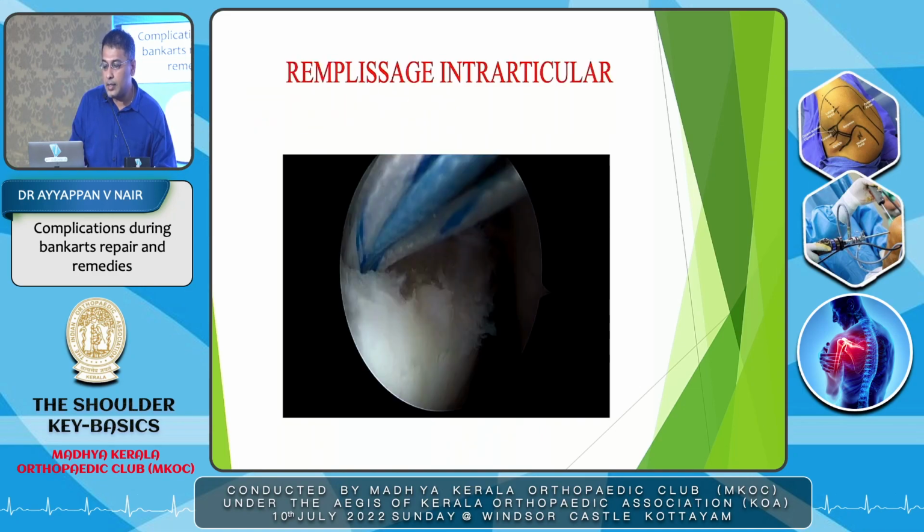So then that is about what are the normal complications. And the other thing is a complication which we feel. So how much of a bite? The bite I showed you, how much of a bite. Lasso, how to take it. And there are instances, if you put a lot of force on a lasso, it can break. One of my reused lassos has broken. So we have to go in and take it out.